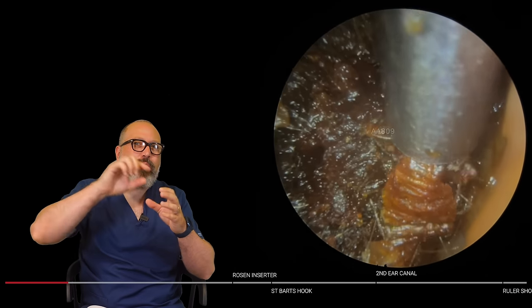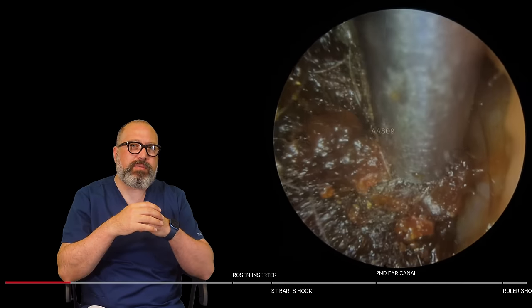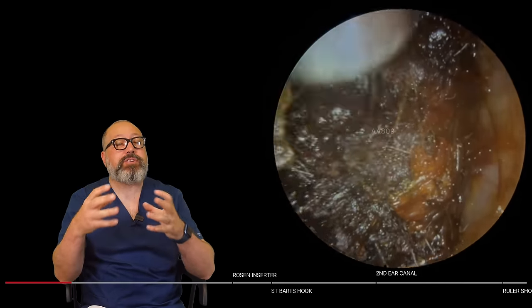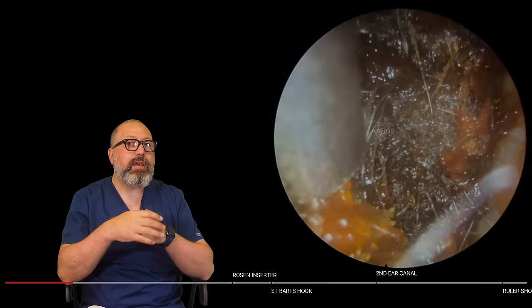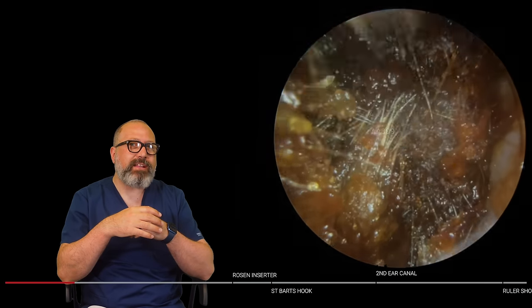And you can see I'm working almost like a clock face around the outside edge of this wax plug, looking for any looser sections, any sections we could exploit to pull out. But at the moment, it's proving difficult to get anything moving in here.